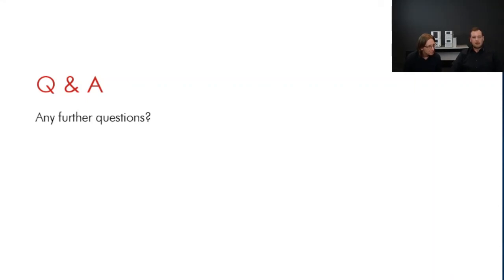So Young is asking if the support scripts would be different if we're using the really large manufacturing machines, namely the D90, which we have. The support scripts are applicable across all the machines. It's purely about the connection from the build platform onto the model, to make sure it's not going to break at the breaking point during the printing process, so that you have a sufficient amount of supports.